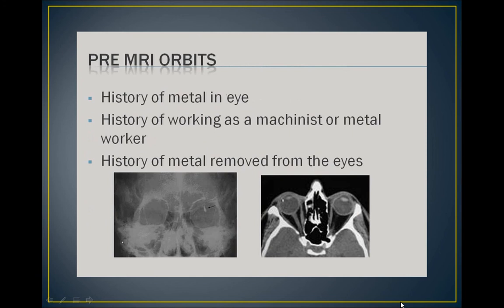In some cases, patients will remember that they had something in their eye, but since then have had it removed. In this case, we should follow our employer's protocol, and for safety reasons, they should get an X-ray anyway, just to be sure. If something were to happen to the patient, it is your license on the line.